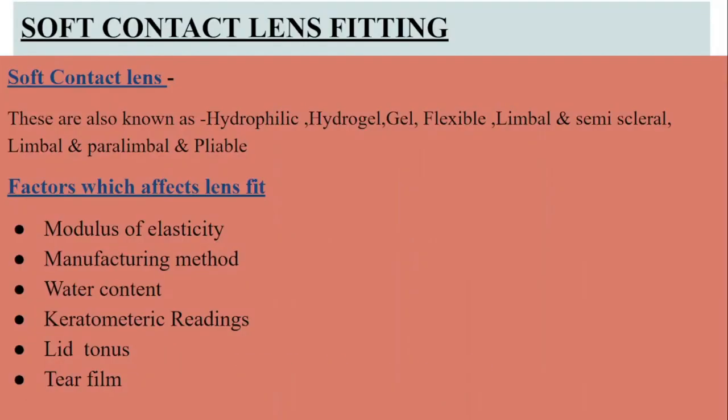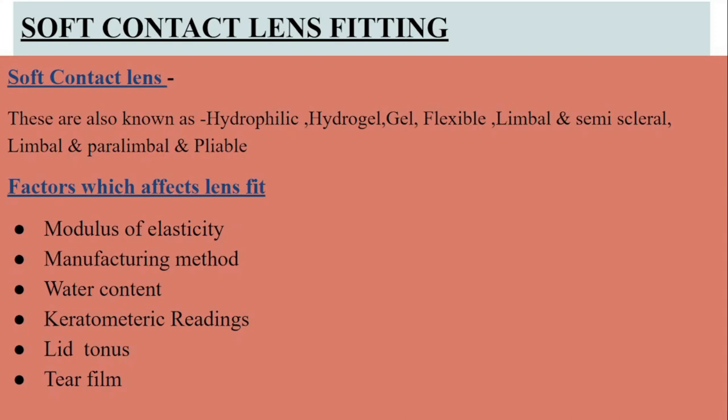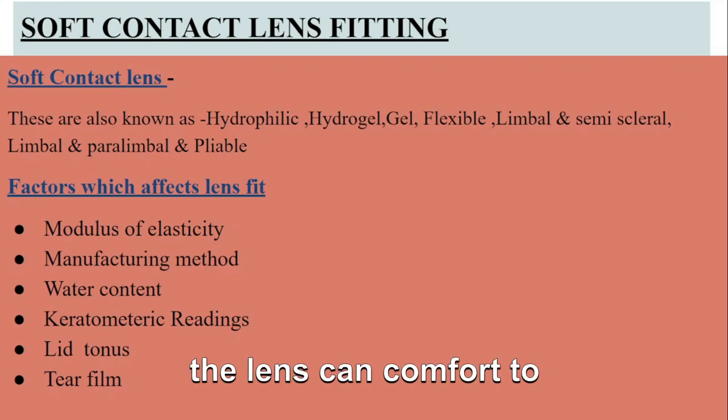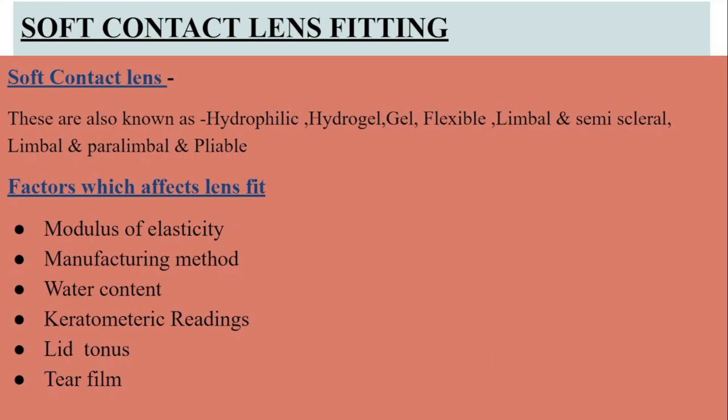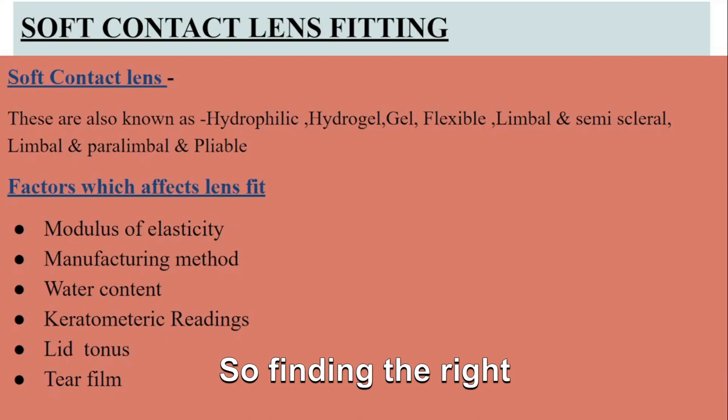Soft contact lens fitting. When it comes to fitting soft contact lenses, there are several factors that come into play. Let's take a look at some of the key factors. Number one, modulus of elasticity. This refers to the flexibility and softness of the lens material. It determines how well the lens can conform to the shape of your eyes. Different people have different eye shapes, so finding the right modulus of elasticity is important for a comfortable fit.